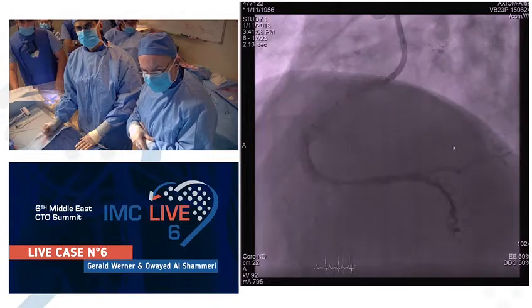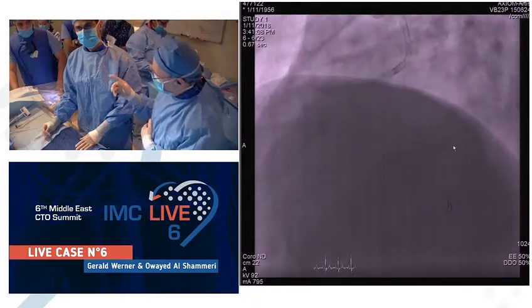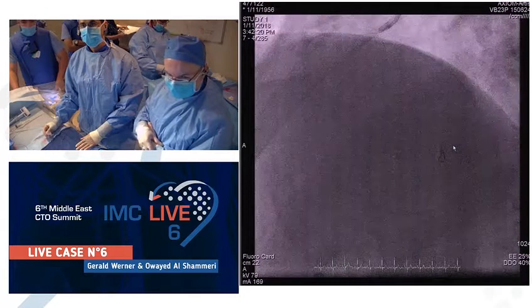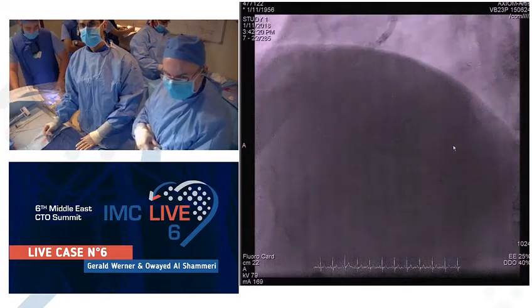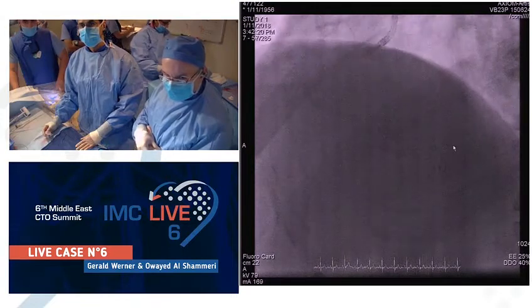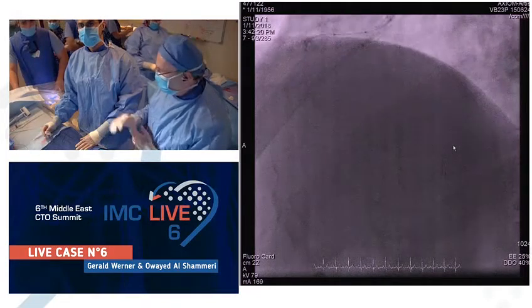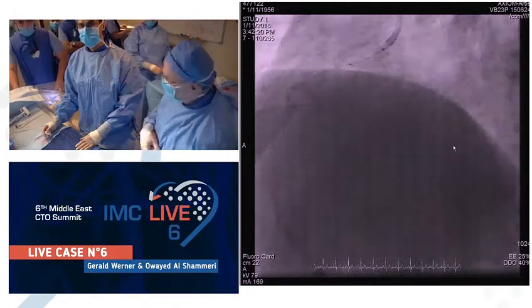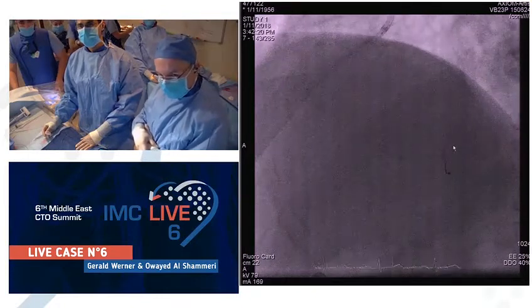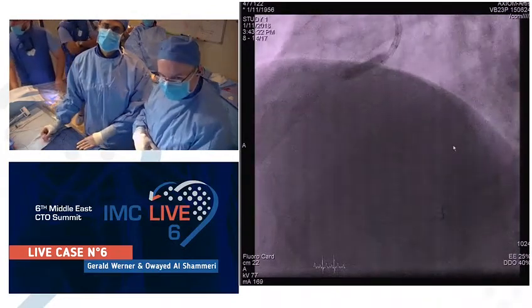This is already the ostial stent deployed. After this, we went with a 4.5 non-compliant. This is probably the non-compliant inflation here. You see calcium, it's an aorto-ostial lesion with calcium in the aorta, like renal disease. Yeah. I hope it stays open. But again, the expansion was very easy, so we didn't do rotablation here. Next.